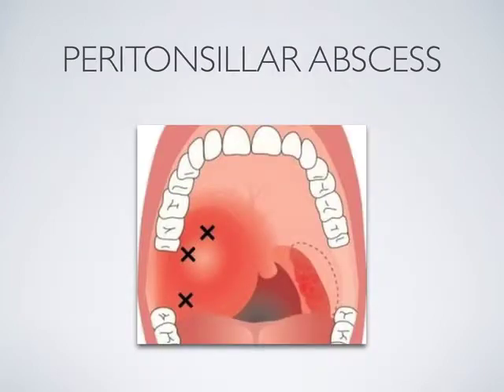The patient is placed in a seated position and given a basin and tissues to use as needed. A tongue depressor is used to retract the tongue and expose the tonsil and soft palate. A 1-second spray of lidocaine is applied to the soft palate mucosa just lateral and superior to the tonsil. Topical anesthesia will be obtained in 30 seconds.